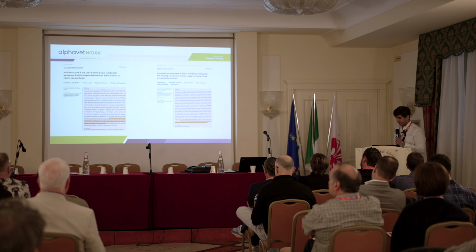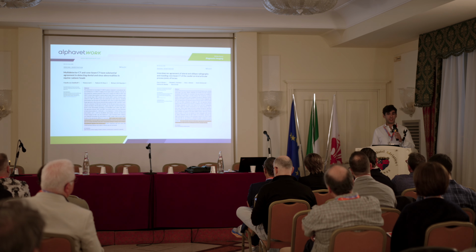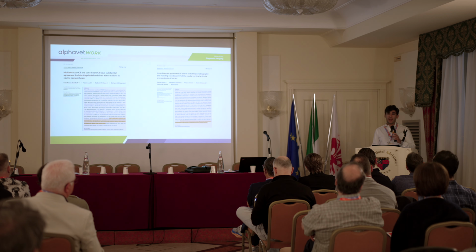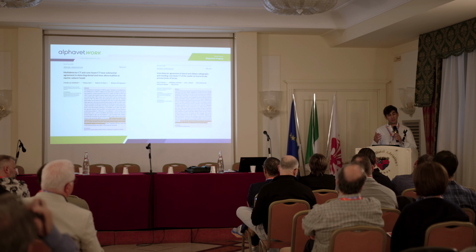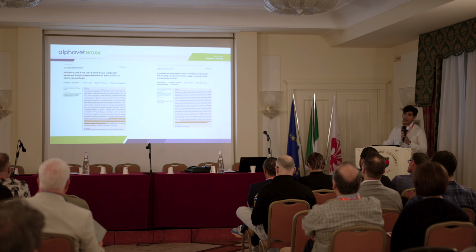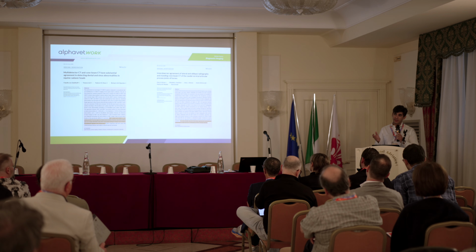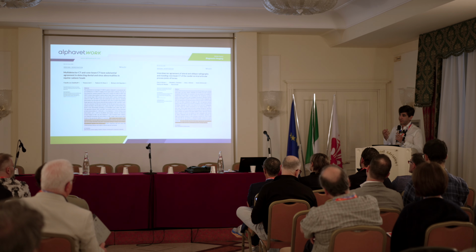I was at La Cyrale, the best training center for equine sports imaging, and they had a CT, but it was stressful to do the caudal cervical. With these machines you can go to the caudal cervical, and now we evaluate also in equine the similar wobbler syndrome. That's why the caudal cervical is very important.